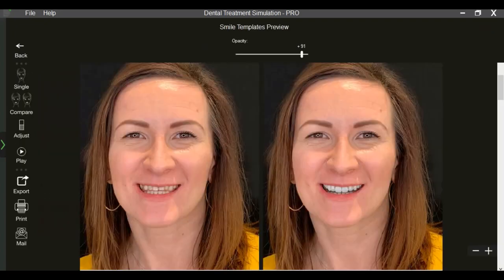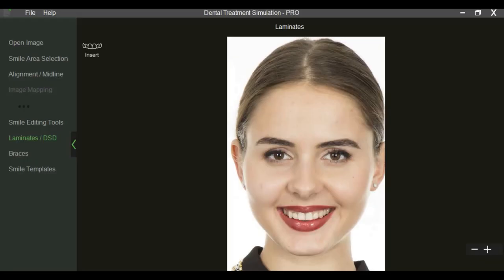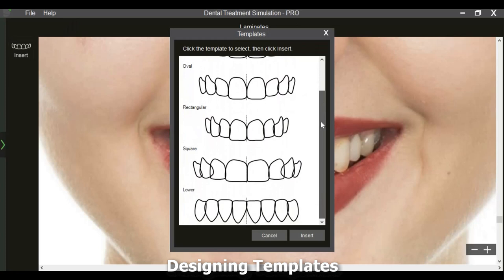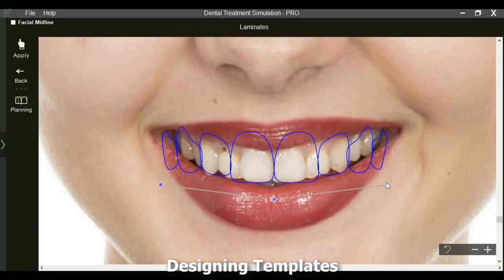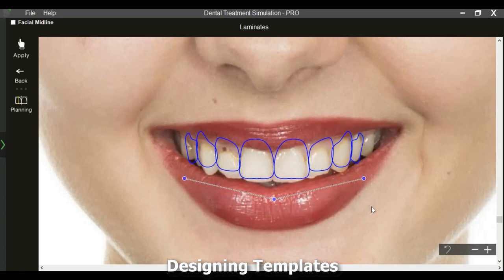Smile simulations have a significant role in patient consults, creating an emotional connect and better case acceptance. DTS Pro has a customizable library of upper and lower teeth templates. We can select anywhere from a single template to eight templates of the desired shape. The inserted templates can be adjusted according to the smile curve.